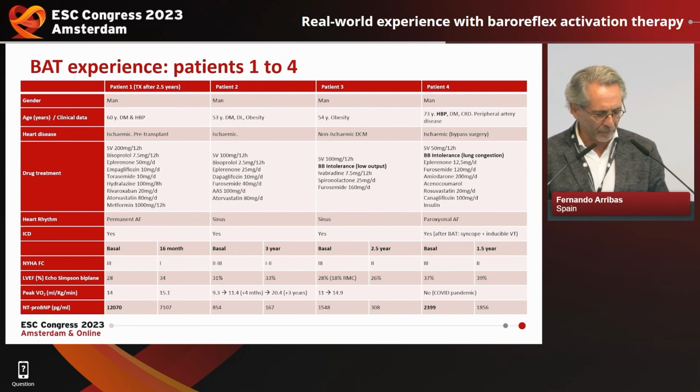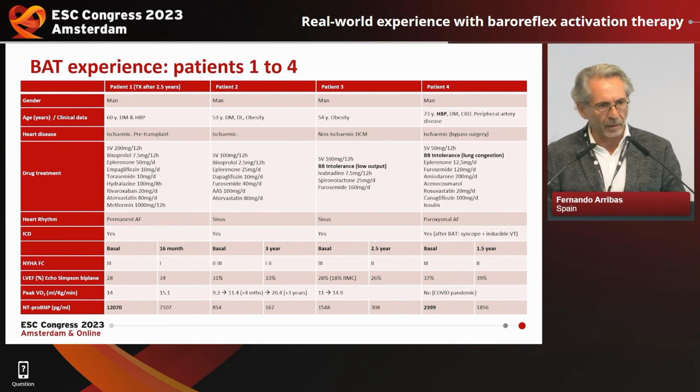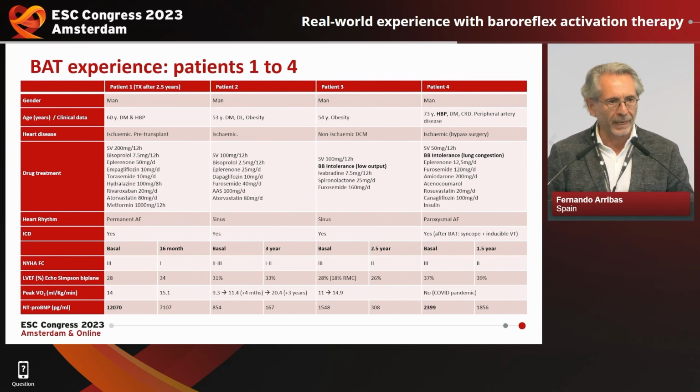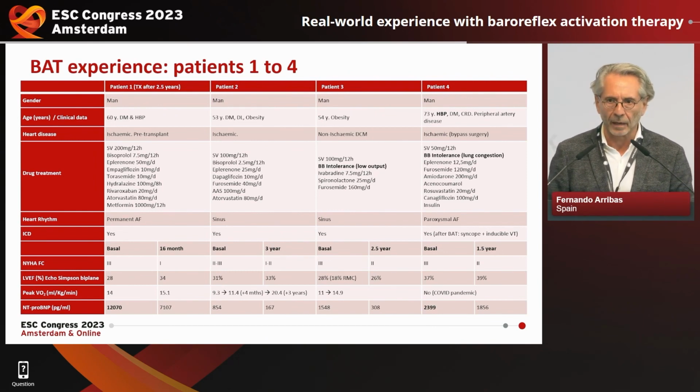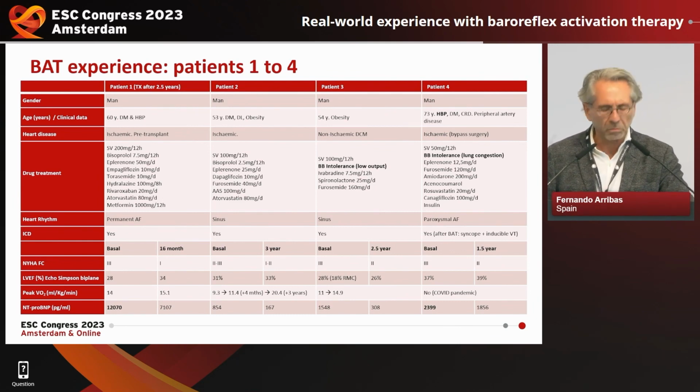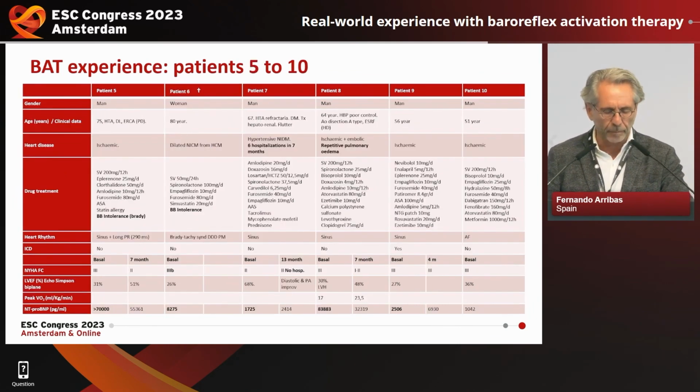This is important. And as you can see in the lower rows, some of the patients had significantly high NT-proBNP levels, and despite that, we introduced the therapy. In some patients, we performed some controlled effort tests, and we could see how in the patients we did it, it improved. The heart failure functional class, the NYHA, is on the 4th row from the bottom, and you can see there is a significant general improvement.